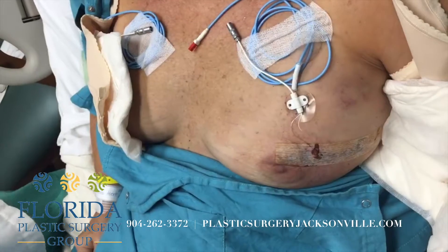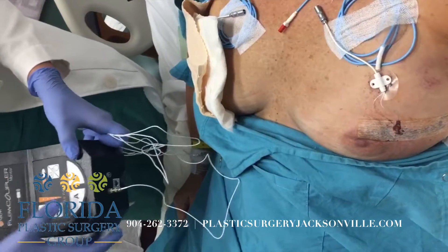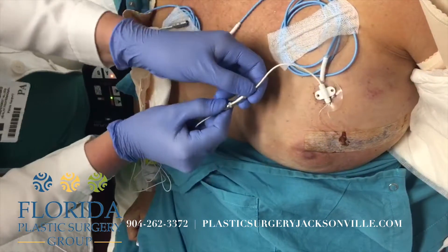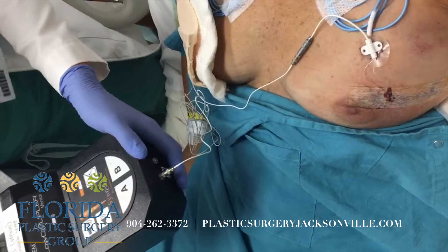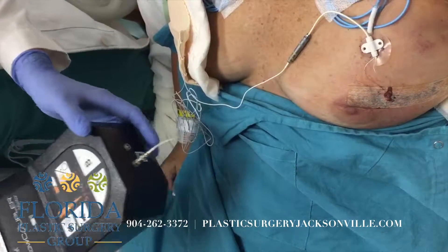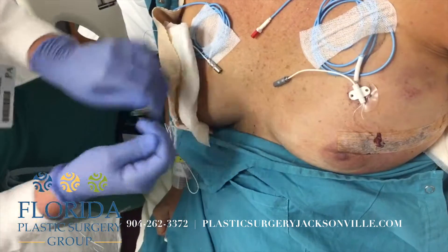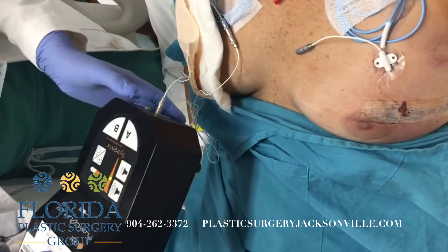Now we'll monitor the vein. Make sure when the cord is plugged in, it's plugged in, then turn the machine on. This is the correct sound — it should sound like swooshing. This is also the correct sound.